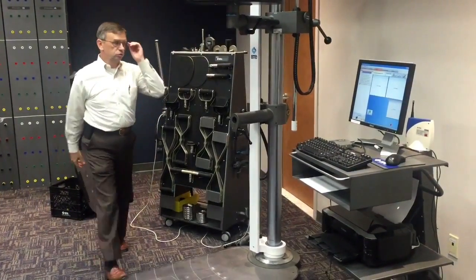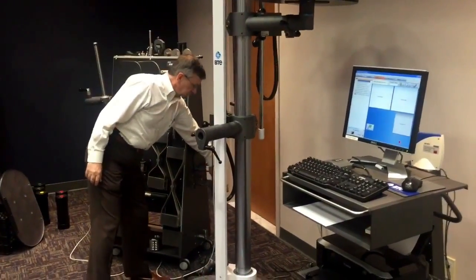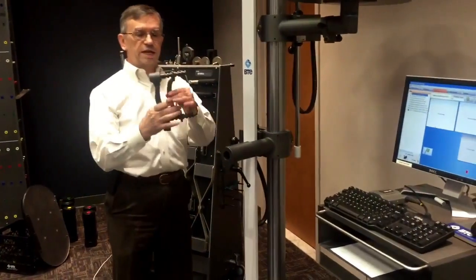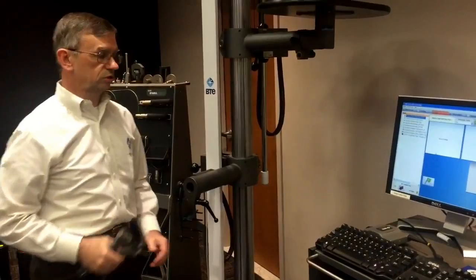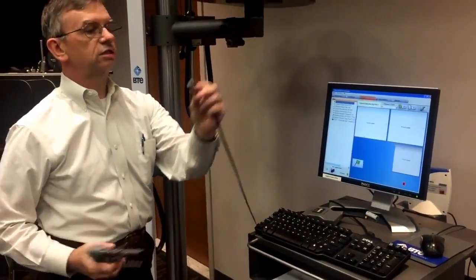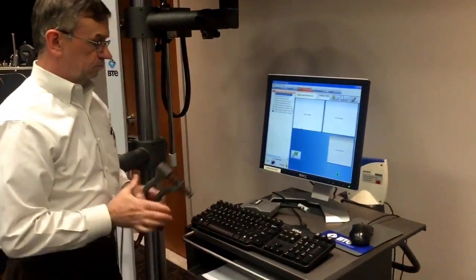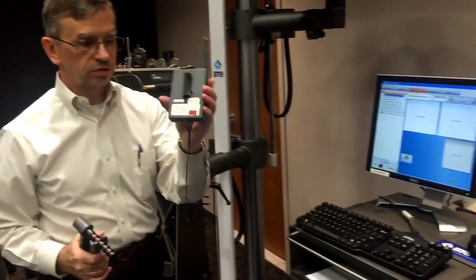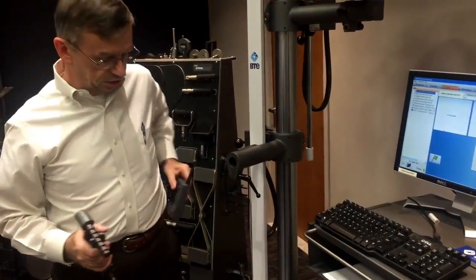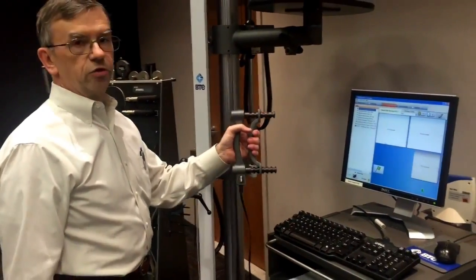As we move to smaller muscle groups, some common strength tests such as hand grip — if we just want to measure grip strength — a quick disconnect cable plugs in and connects to a wireless transmitter. This transmitter gets clipped onto the belt of the patient, and now we're ready to do a grip strength test.